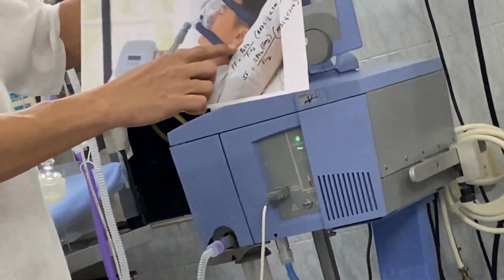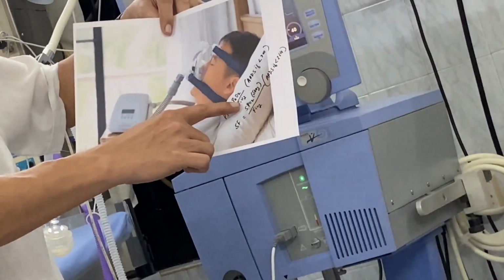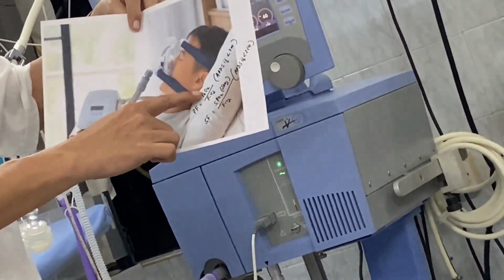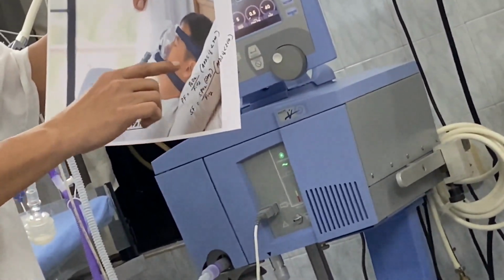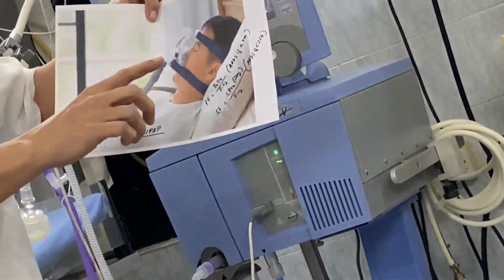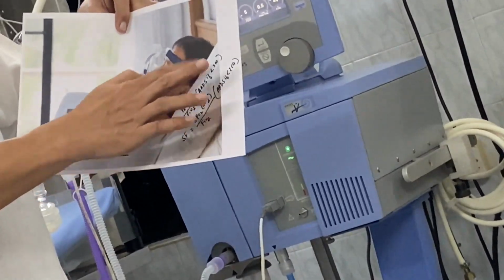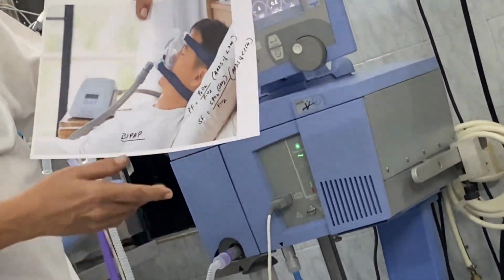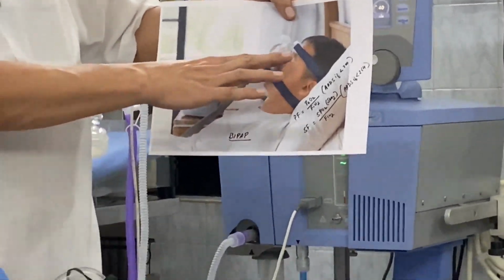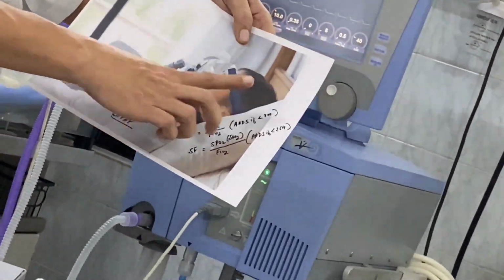Suppose on blood gases you get PaO2 of 70 and FiO2 of 1, you are using 100% oxygen, in spite of which your PaO2 is 70. So PaO2 by FiO2 becomes 70. When this value falls less than 300, that means your patient is in ARDS, if you rule out other causes, especially cardiac causes, in a patient who is on BiPAP or CPAP or ventilator. So we use PF ratio.